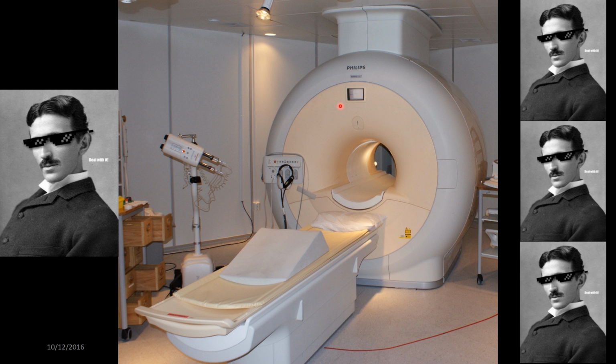Once they're placed into a magnetic field, these precessions change. If you imagine the atoms are sat as they are, just wobbling about, and then each atom is precessing on an axis, like the Earth spinning on its own axis, it will precess in a certain way. I'm probably getting into a bit too much detail, so what I'll just say is that they're exposed to a huge magnetic field, and they precess differently. They precess either facing north or south. Then we use a powerful radio frequency pulse to destabilize these precessions, so they switch directions. When these precessions switch directions, they give off a radio frequency pulse in return, and it's picked up by the scanner's detecting coils inside.